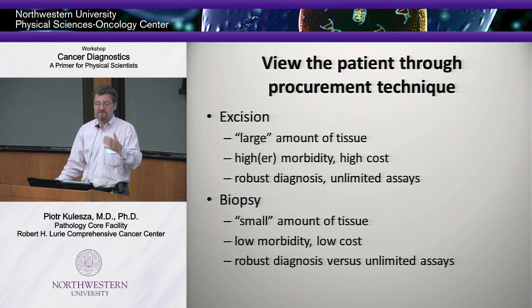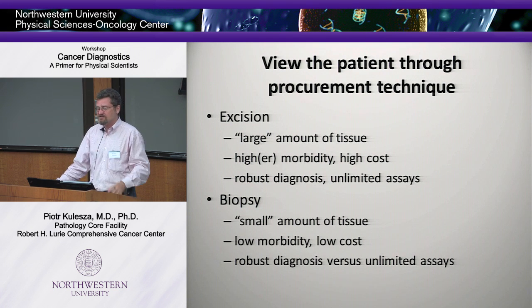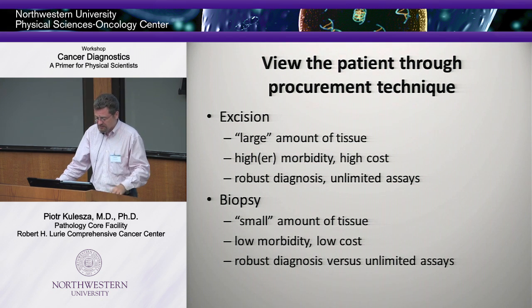Is it invasive? If so, how deep? In a colon resection specimen, the whole staging and prognosis of a patient depends on this. And you have what I call unlimited assays, because in the era of molecular technologies, really, if you have an excision, you pretty much can do whatever you want. And that's not the limiting factor.